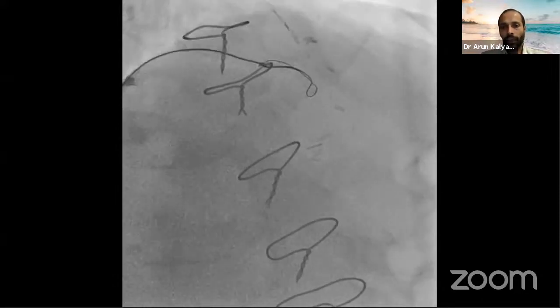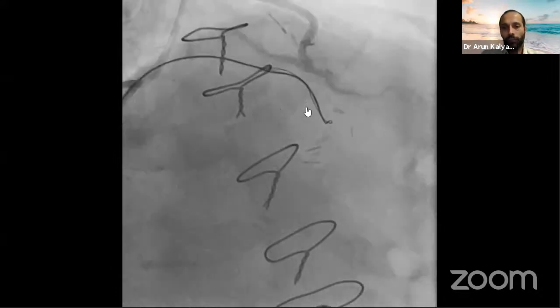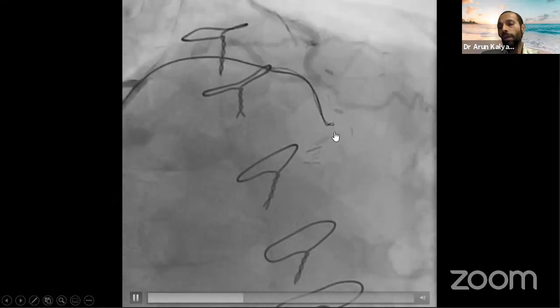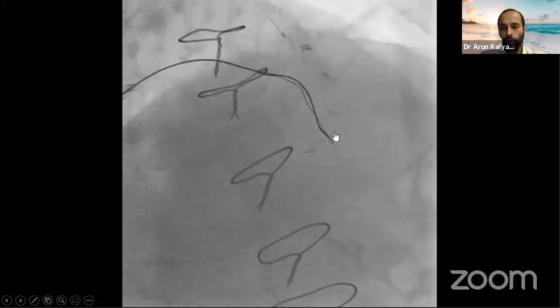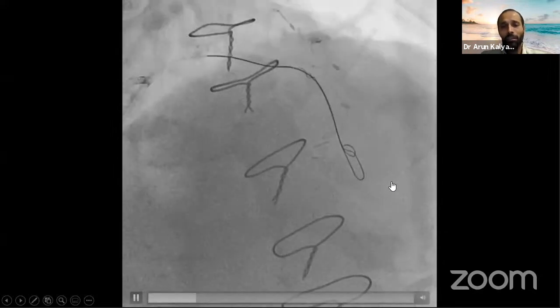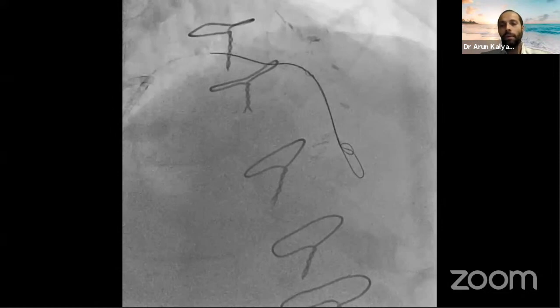So once the knuckle was done, right? You can see that my plan is to do ADR, and I'm following the knuckle with a microcatheter. That's the microcatheter. I think you can see the pointer here. That's microcatheter knuckle. Trying to wire this is super hard just because it's long, there's tortuosity, and I don't know the course of the vessel. So here it is going. I got a big knuckle. I'm all set. I'm going to go get my Stingray balloon down and re-enter.